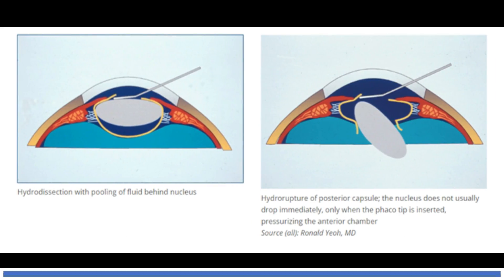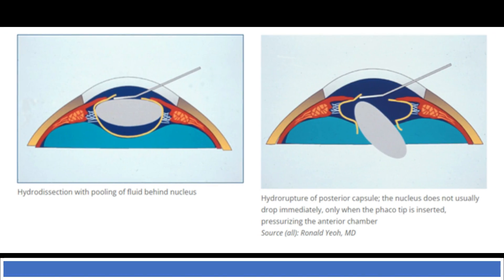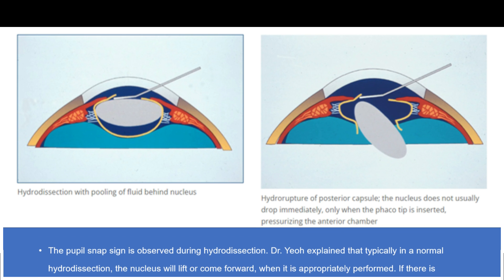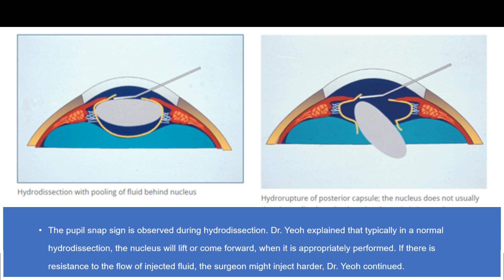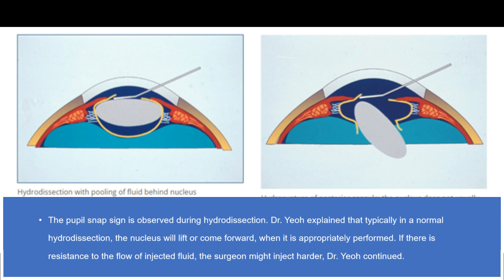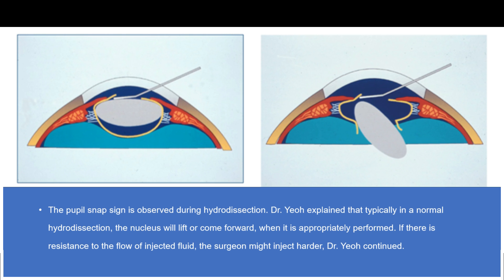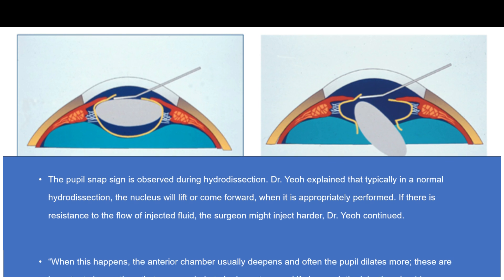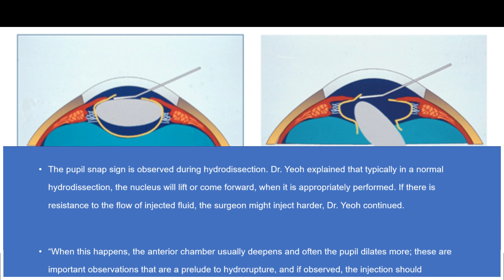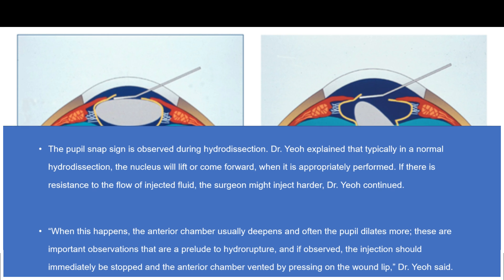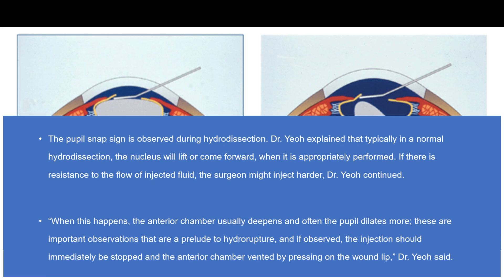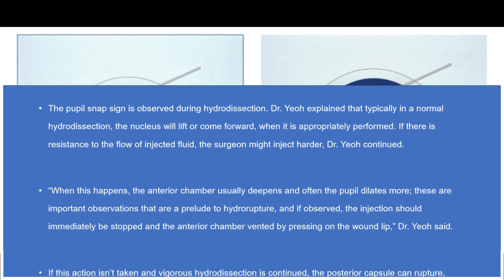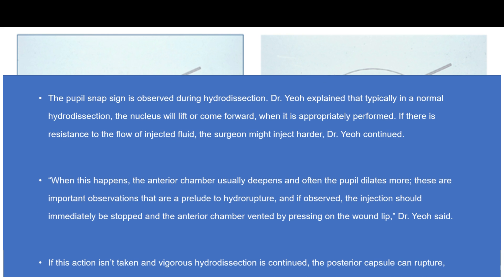It is observed during hydrodissection. In normal hydrodissection, the nucleus will lift or come forward when properly performed. But if there is resistance to the flow of injected fluid, the surgeon might inject more, and when this happens, the anterior chamber usually deepens and often the pupil dilates more.